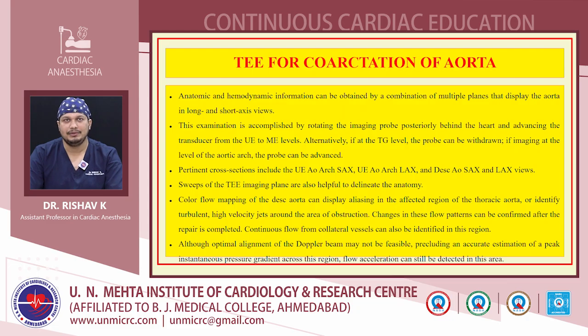in long and short axis views. This examination is accomplished by rotating the imaging probe posteriorly behind the heart and advancing the transducer from the upper esophagus to the mid-esophagus levels. Alternatively, to the transgastric level, the probe can be withdrawn. If imaging at the level of the aortic arch, the probe can be advanced.